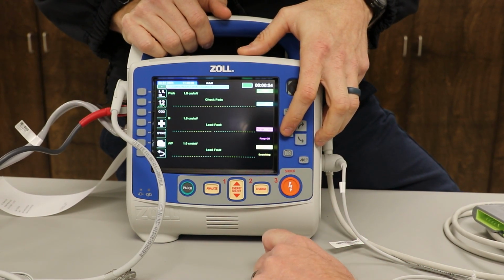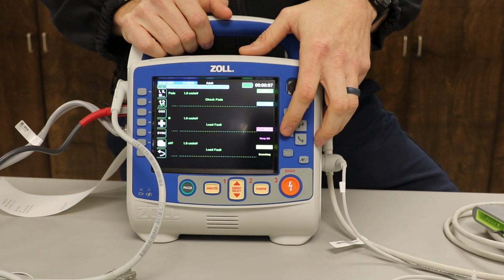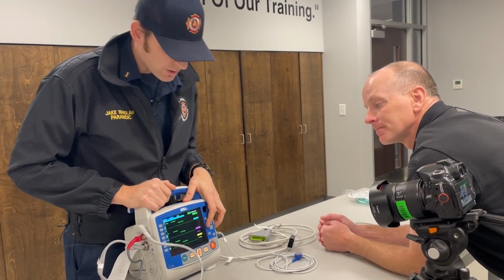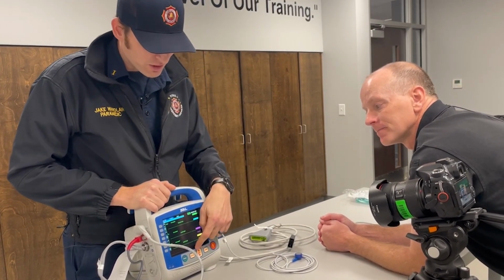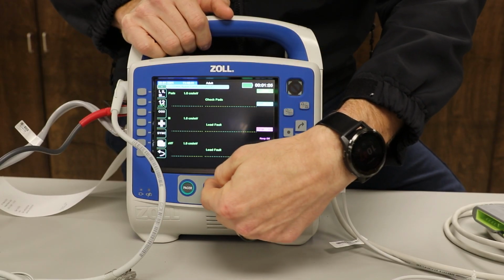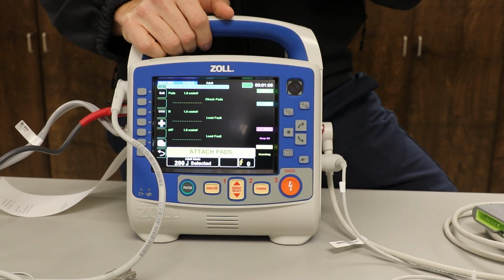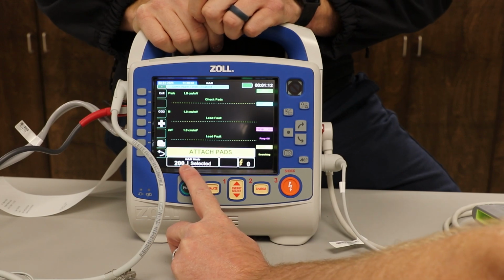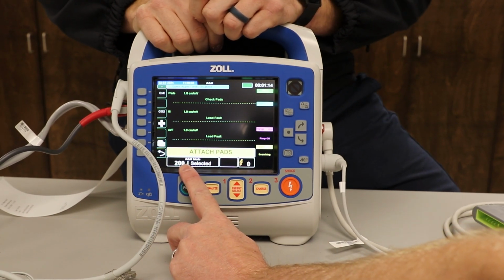This is your AED. So Jake, if I'm in the adult mode and I put somebody on pads, how do I make this into an AED? So if we're making it into an AED, you see the number 1, you see analyze. All you have to do is hit the analyze button. Attach pad. You have now turned this into an AED. And if you notice, I'm at 200 joules. The AED automatically goes to 200.